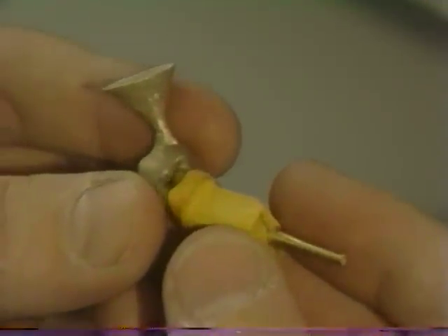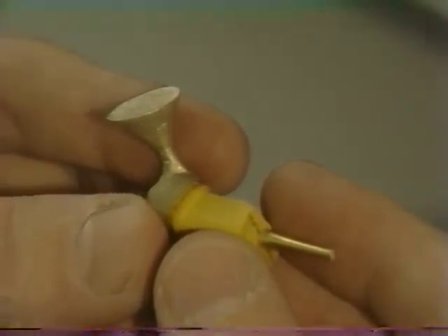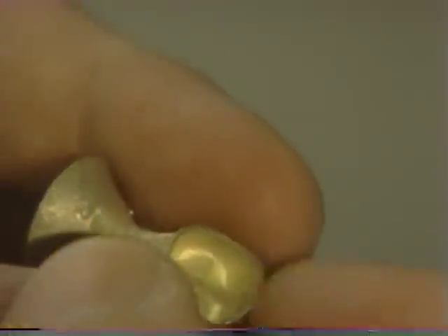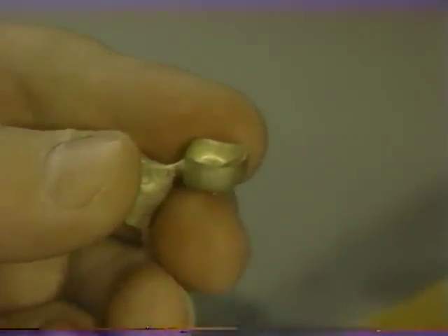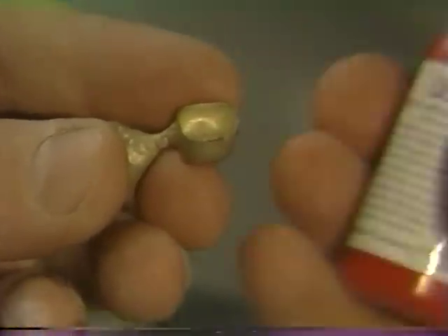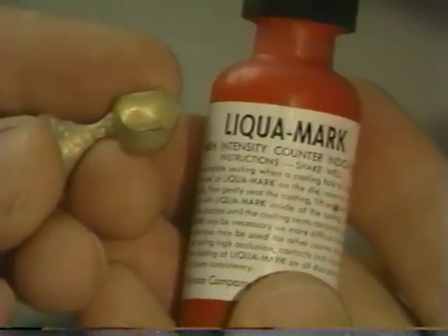Once all nodules and any other voids have been removed, the casting is carefully tried on the die until some resistance against vertical displacement is felt. The casting is then removed from the die and again the internal aspect is inspected to see if it can be determined visually where it may bind. If not possible, a marking agent — typically a water-soluble paint — can be used to coat the inside of the casting.